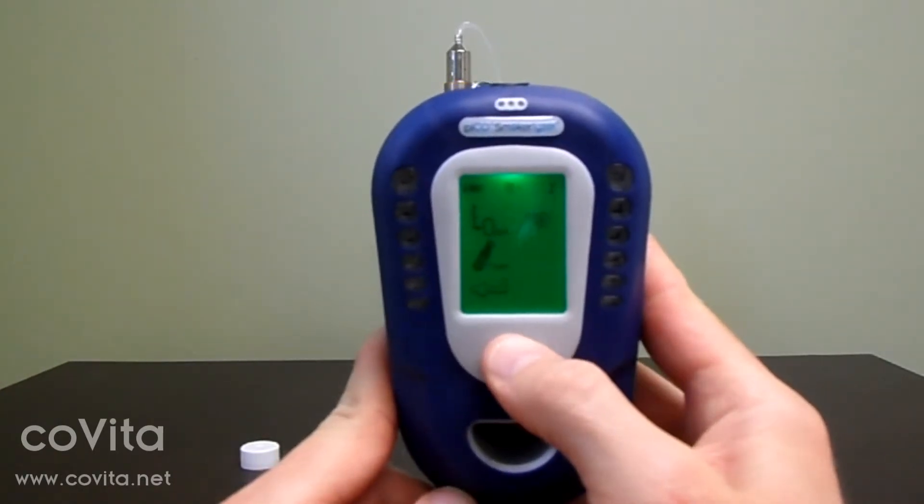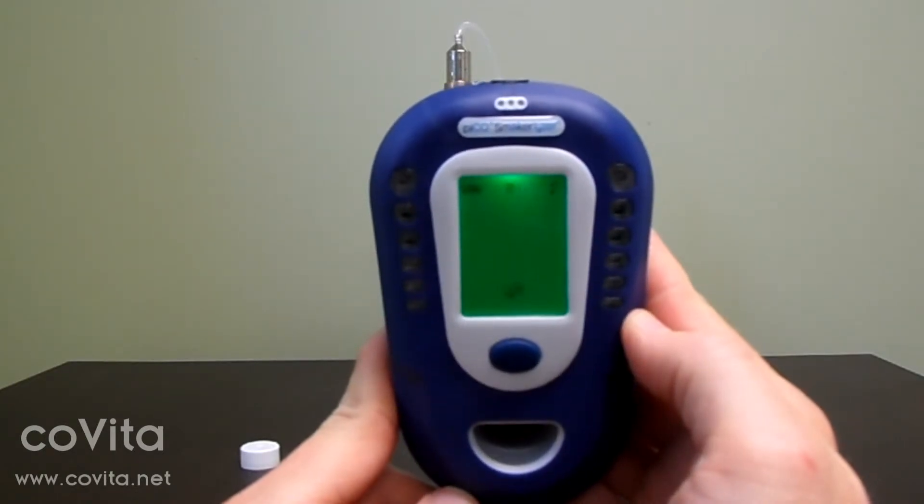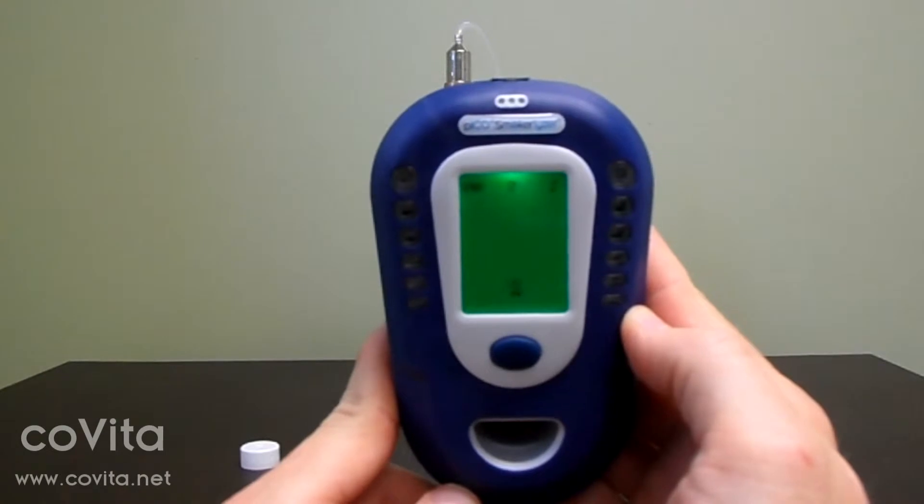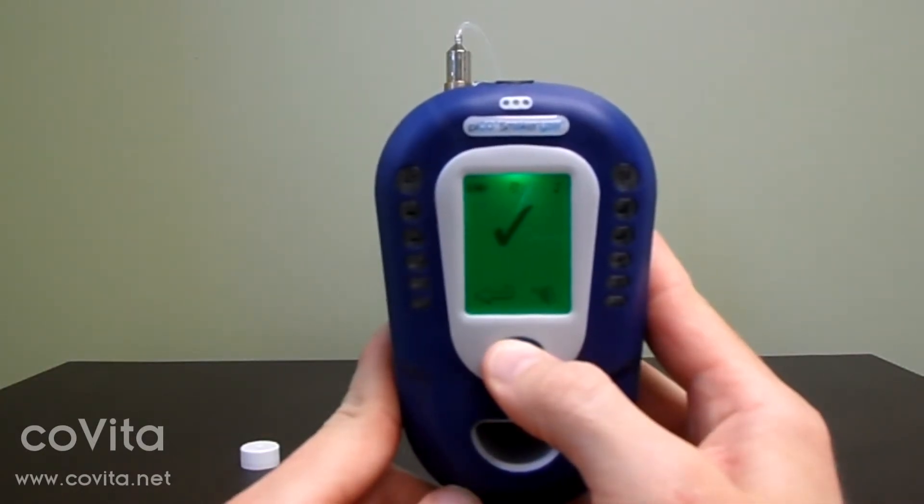On the next screen, double-click to select the zero scale. Let the zeroing process cycle through with the hourglass until you get the check mark. Double-click to return to the previous screen.